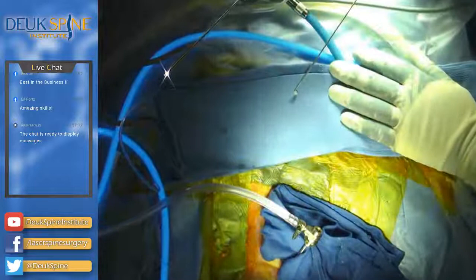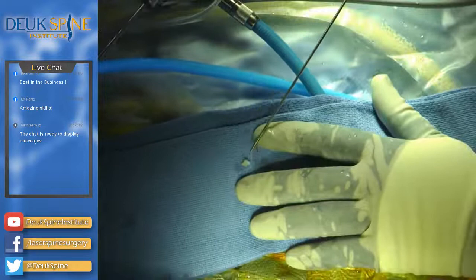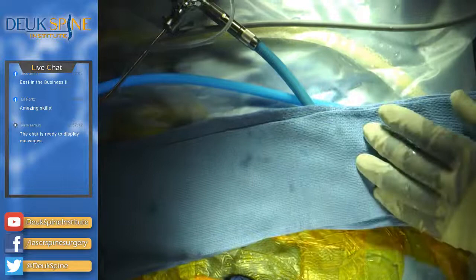See that? John, zoom in. Yep, we see it. That is a piece of herniated material, disc, herniated disc, right there. Okay? Bam. And there's my little grabber. It's an endoscopic grabber. Look at my finger, just for comparison. Look how tiny that is. So we grabbed it in the back and pulled it out. Here you go. Where do you want it?